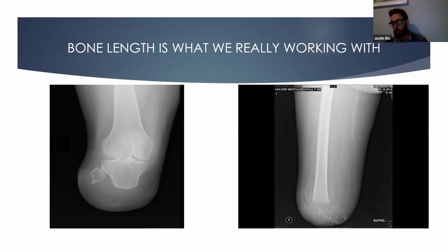We've got a case where a lady came in which looked like a perfect length transfemoral amputation with a nice long lever arm. But when we started actually palpating the stump, we realized that the femur was in fact very short, and half of it was made up of soft tissue, which offers nothing other than elongating the appearance of the stump. This makes it extremely difficult for her to don her liner, because she has to then control the soft tissue with the liner. So a revision surgery will most likely be indicated. Well, time will tell at least.